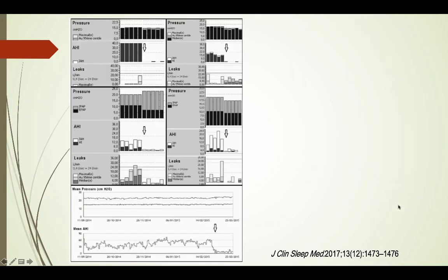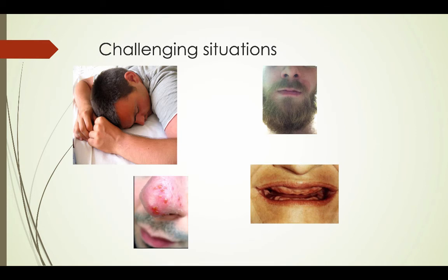And these patients continued to use CPAP with an oronasal mask with the addition of cervicomandibular support up to 1 year with excellent adherence. So this is something you can look for in your patients who choose an oronasal mask, despite your explanations that a nasal mask has better clinical outcomes than an oronasal mask.